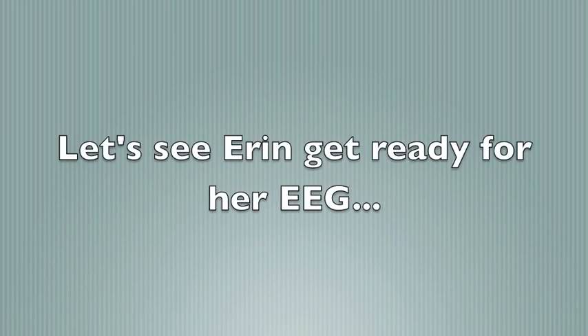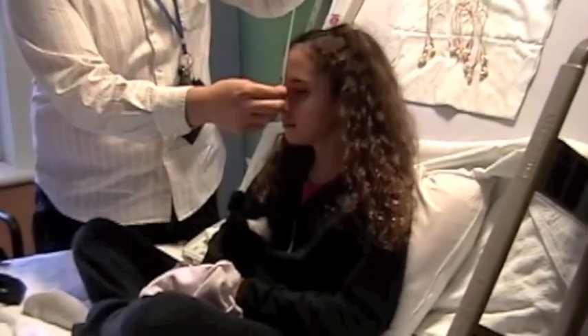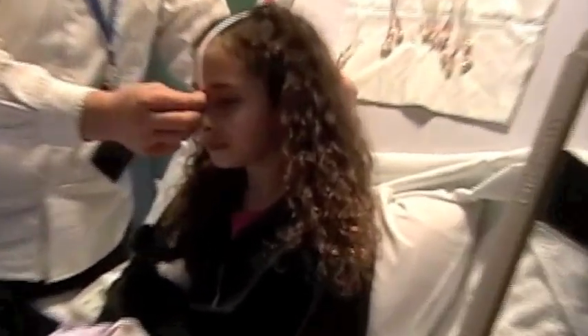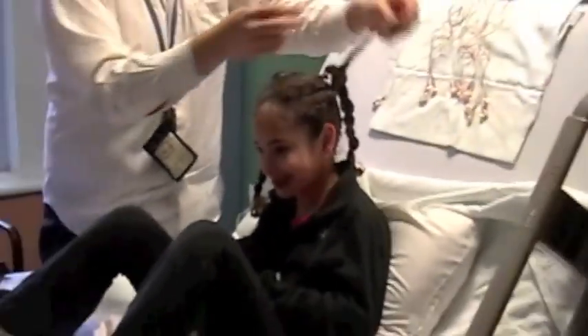Let's see Erin get ready for her EEG. First, the technician needs to measure your head to know where to place the electrodes. It is very important that you stay still as a statue as he does this. Since Erin has long hair, she has to get her hair parted to fit the electrodes on her head — it is kind of like she is at the hairdresser.